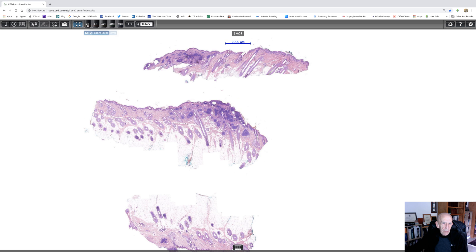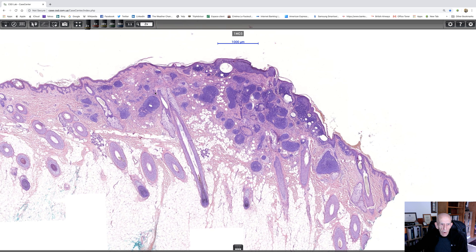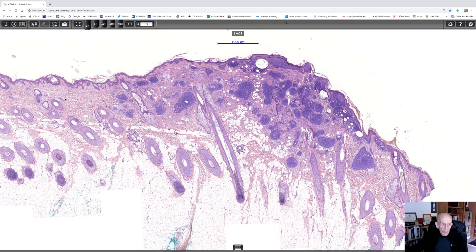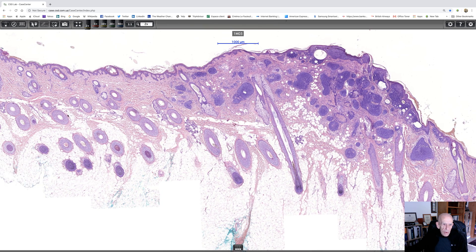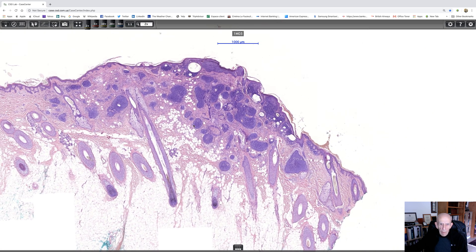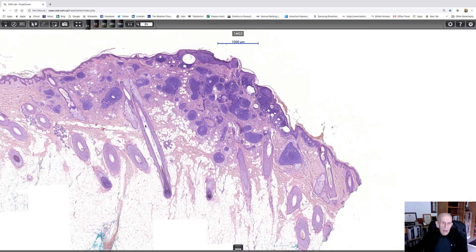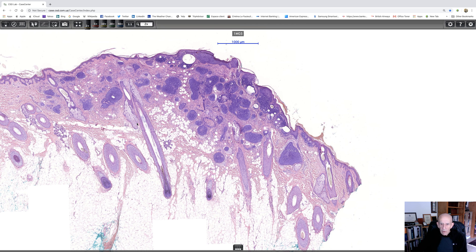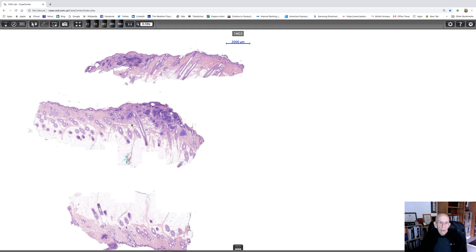Let's look at this at a little bit higher power and see what we've got. There is the normal skin, there are the scalp hairs, and then we come across and there's our basaloid cell population. At this magnification, I guess really there only are two differential diagnoses that are worth thinking about.